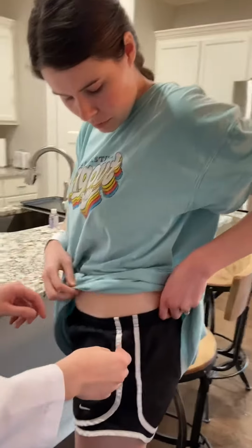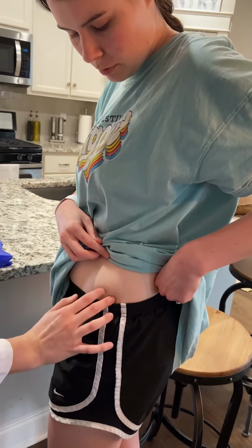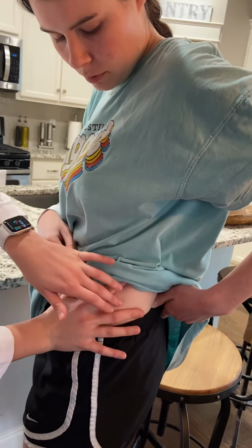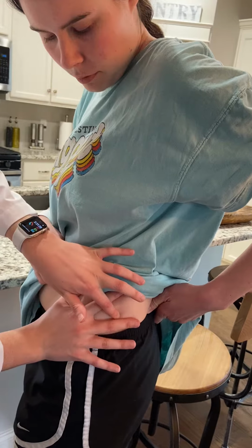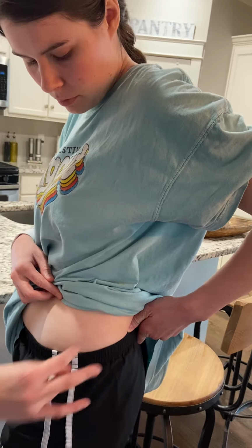And I'm going to have you lift your shirt on this side for me if that's okay. The way I would find this one is I'd locate the greater trochanter. Okay, and I put my palm on the greater trochanter and find the anterior iliac crest and administer right in between my fingers, and I don't see any bruising and the muscle is present.